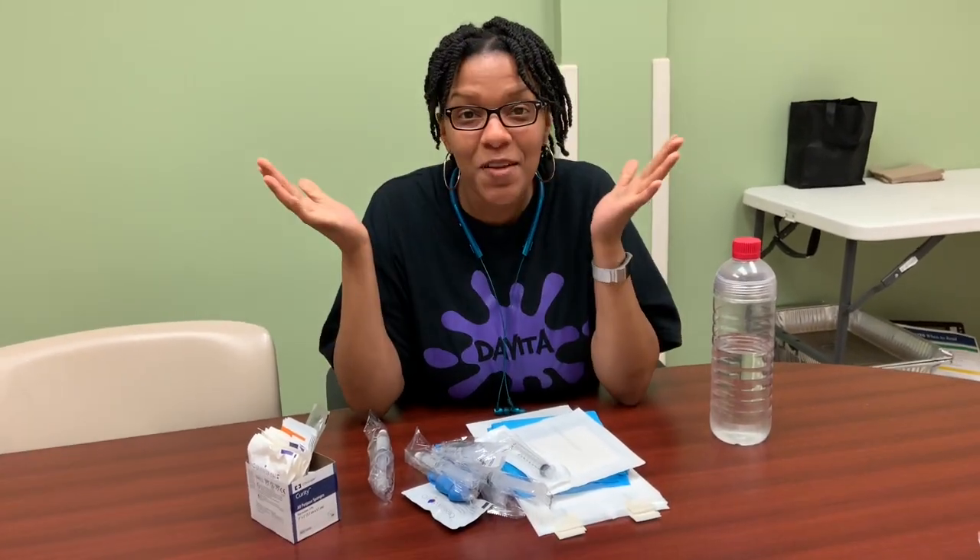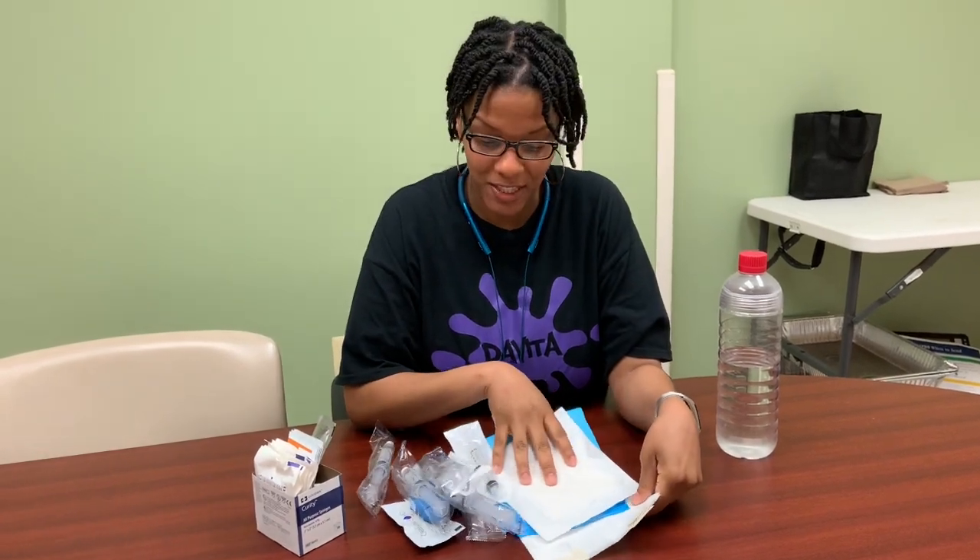What is up you guys! Top of the morning, middle of the evening, bottom of the afternoon — it's your girl Fresh, and I am back with another video. Today I'm going to show you how to make packs. Packs are what we use when we are putting patients on a machine and taking them off — we call them packs.